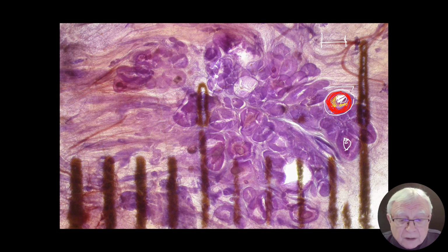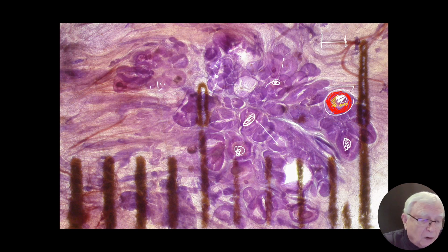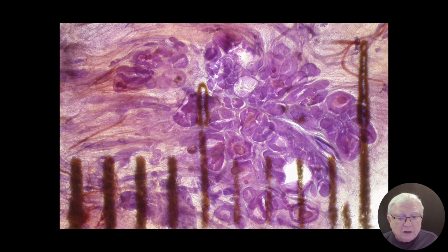Here is a calcification, but there is no calcification here. There is one here. There is one there. And they are so small, we call them microcalcifications. And they are very close to each other. So when we are going to analyze the cluster discernible calcifications, the closeness is going to be an important diagnostic trick. Let me magnify this now.